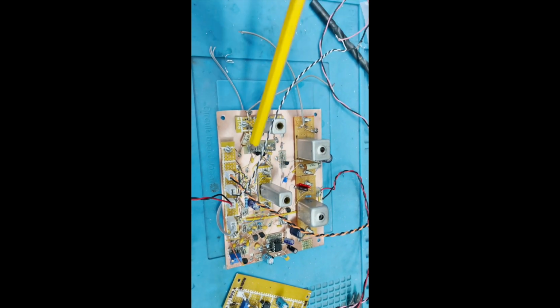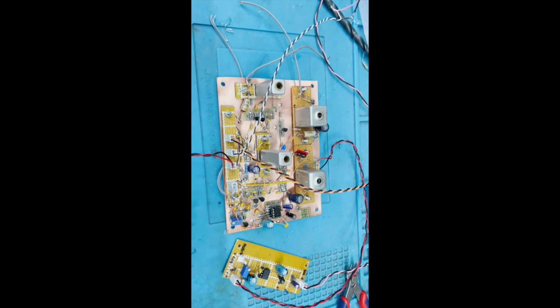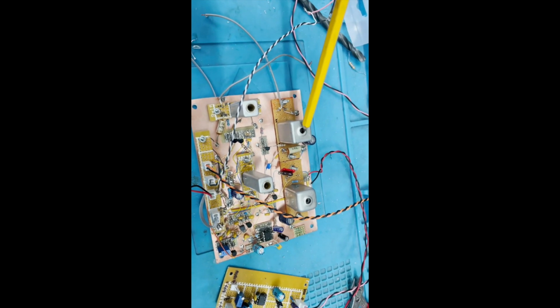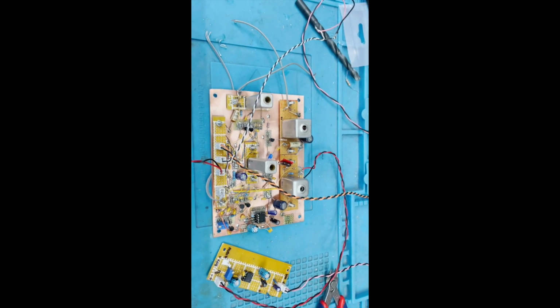In terms of the layout, I don't think it's too critical, but it makes sense to keep this the transmitter section, and then you've got the receiver section along here, and then the audio part is at the back. It seems to work for me. I don't think it would be wise to mix up the receiver and the transmitter sections, because you're probably going to get interference. And talking of interference, it's quite important to have these different coils screened, and I used some old radio coils which I unwound and rewound to do that.